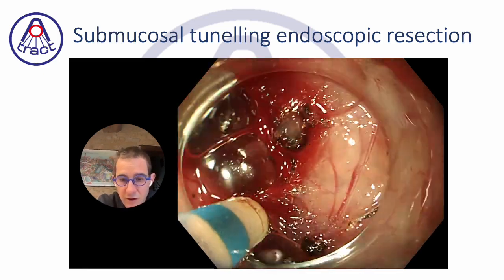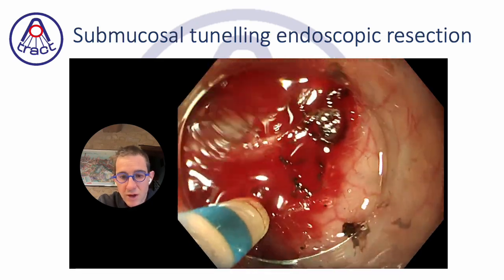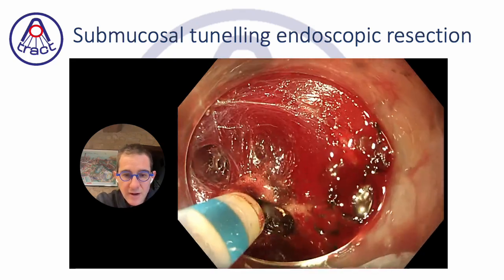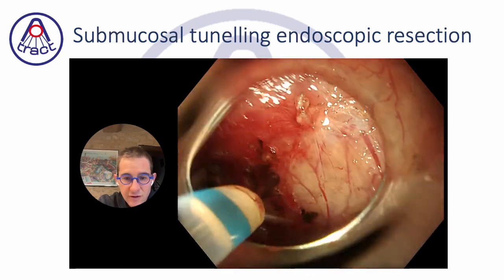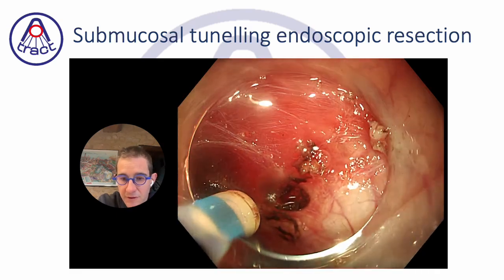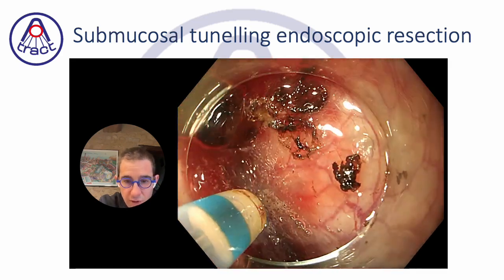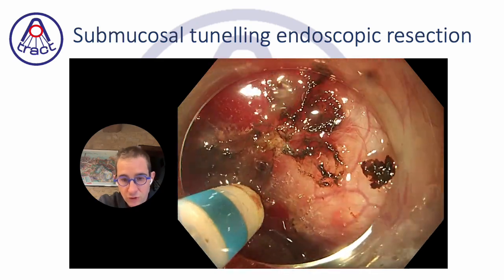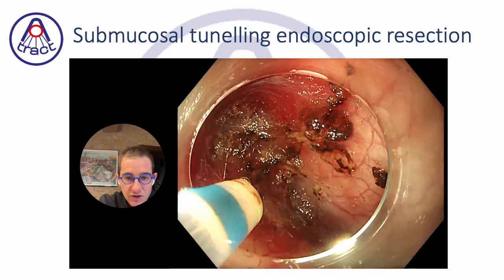Even if biopsy samples were done, the risk of fibrosis is relatively low compared to what we are used to in the colon, for example, where the submucosa is probably thinner, and every biopsy sample on the lesion makes the resection more difficult. In this case, we cannot say that fibrosis was preventing anything. So it was quite easy to turn around the lesion and remove the submucosal fixation. So we make the lesion free.